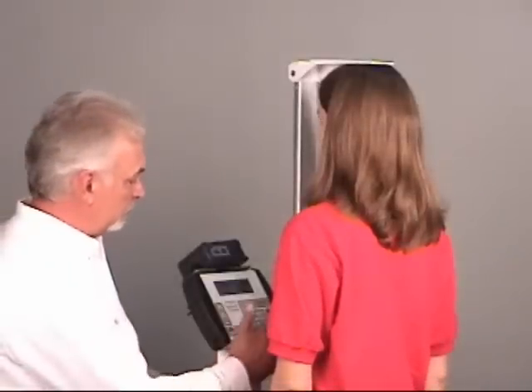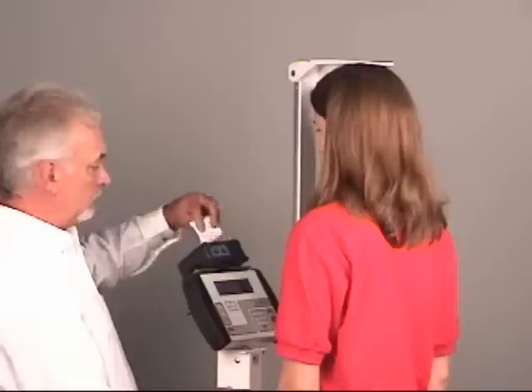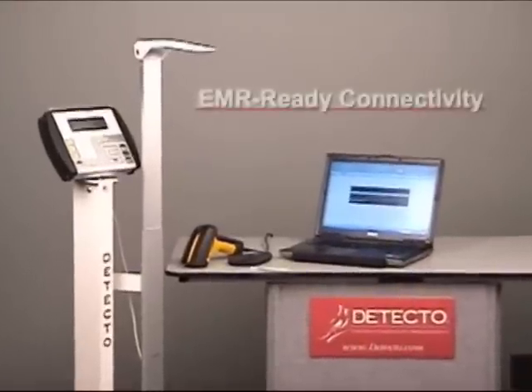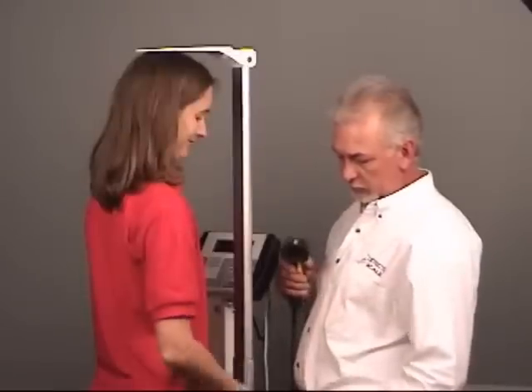By adding the Detecto thermal tape printer, you can simply touch the print key and document date, time, weight, height, and BMI for patient files. A scale for now and future demands at the digital office — Detecto can customize special packages specific to your needs.